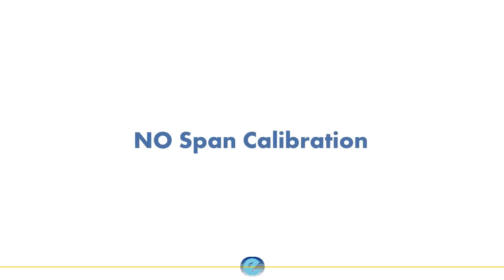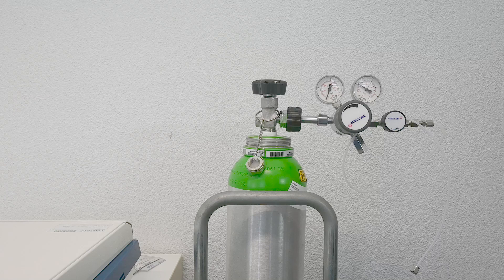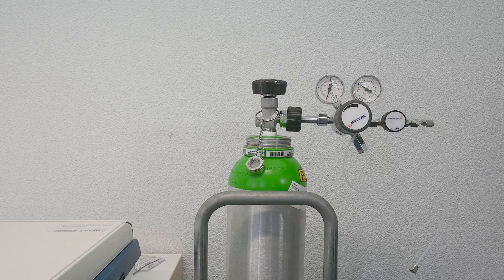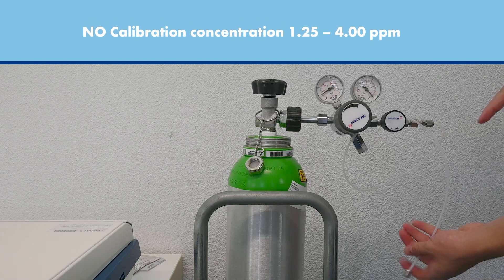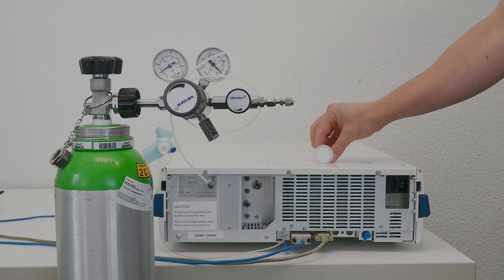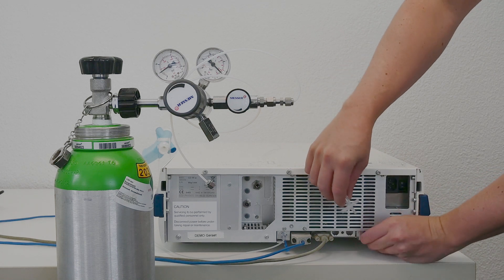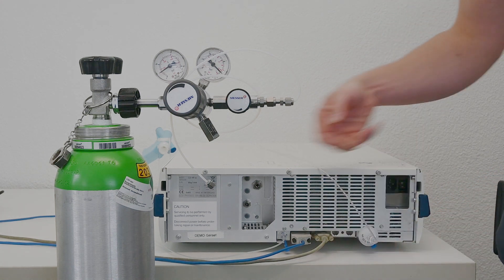For the NO span calibration, you need calibration gas with a concentration of between 1.25 to 4 parts per million nitric oxide in nitrogen gas. Connect the sample tube with the sample filter attached to the calibration port on the rear of the analyzer.